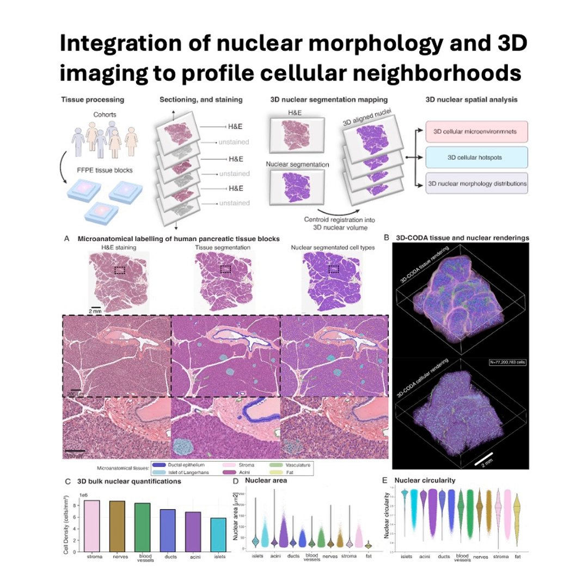And within that volume, they identified and analyzed approximately 77 million nuclei. 77 million? Yes. Just to give you some perspective, that's easily over 100 times more cells than you'd typically analyze on a single standard 2D slide. Wow. That's orders of magnitude more data. Exactly. And it's that sheer scale that allowed them to move beyond assumptions you might make from looking at just a few small, potentially unrepresentative 2D snapshots.